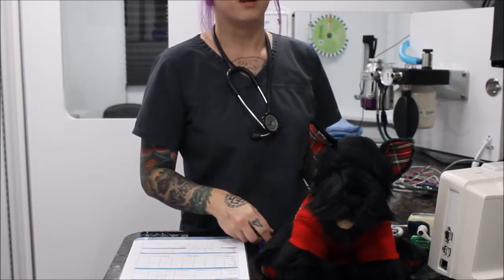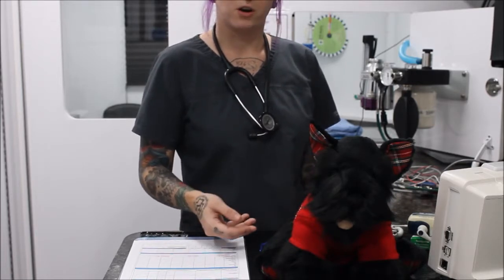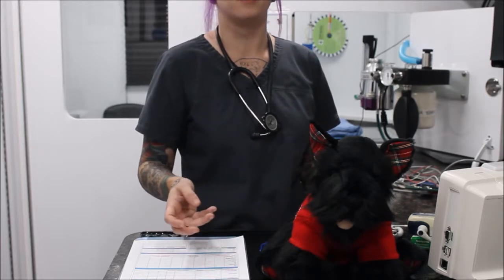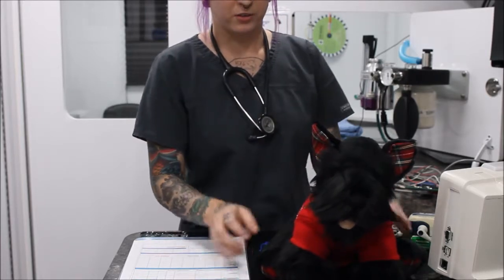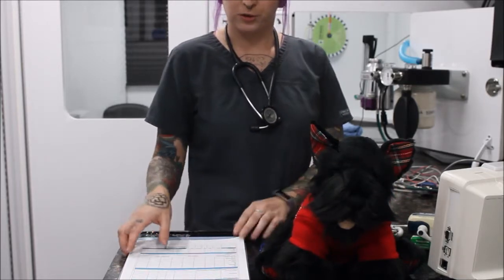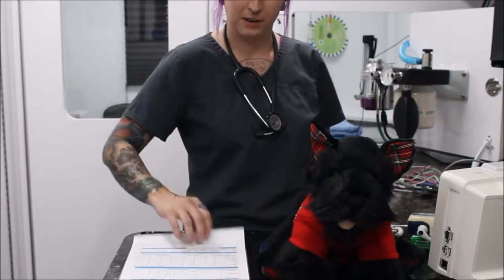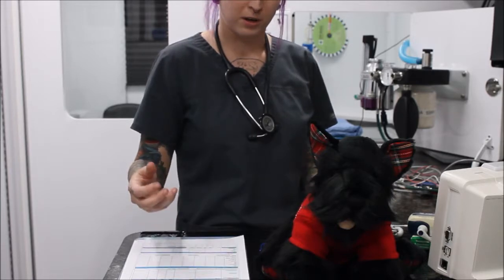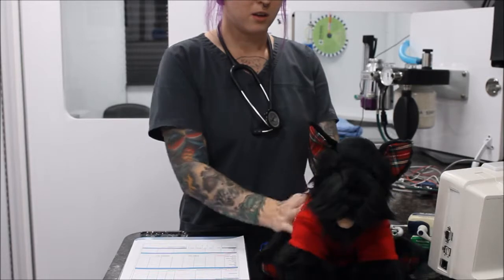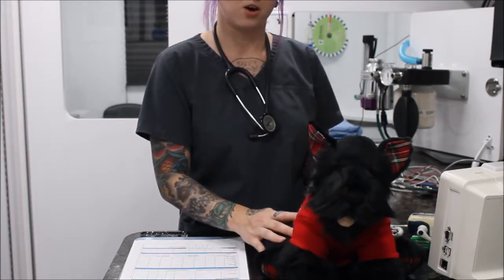And in other cases, our patient could be displaying bradycardia, which is too slow of a heart rate, which indicates they might be too deep and need the anesthetic turned down. So that just depends too on patient status and history as well. We usually will go back in the medical record and check previous surgeries if they've had any, to see if they've had any issues with tachycardia or bradycardia or any other issues previously as well, or ask the owner if they know anything.